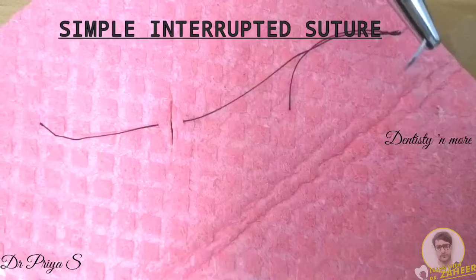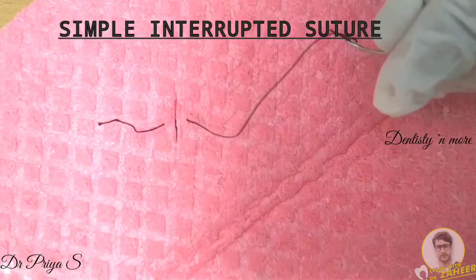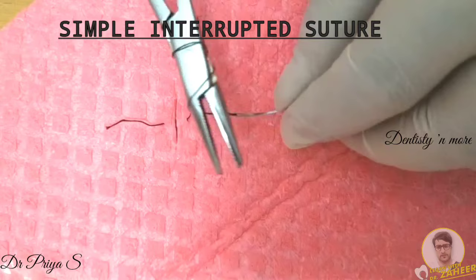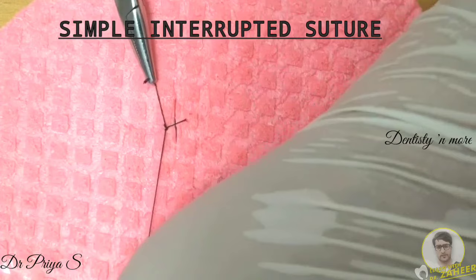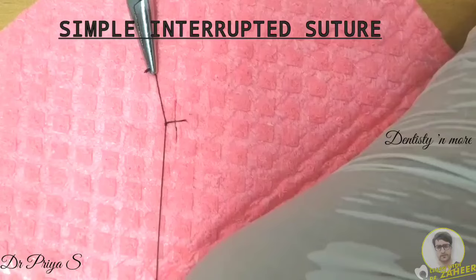To tie a knot — the one we are making here is the surgeon's knot. Make two loops known as throws around the needle holder and grasp the tail end of the suture material. Pull the tail through the loop until the knot is tightened firmly. This is the first knot. Make sure to keep the knot at the side of the wound and not on the wound margin.